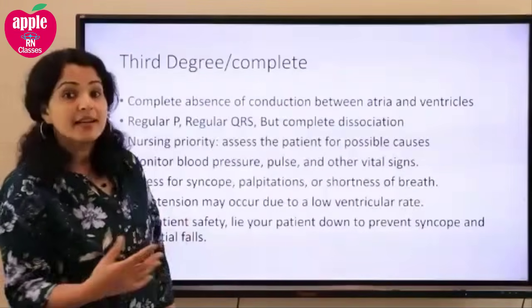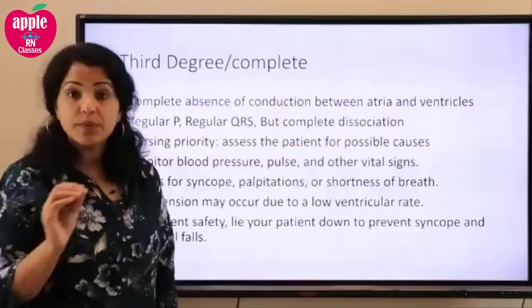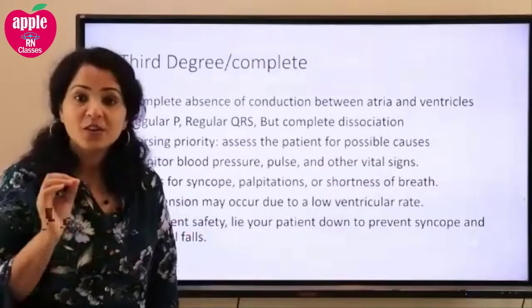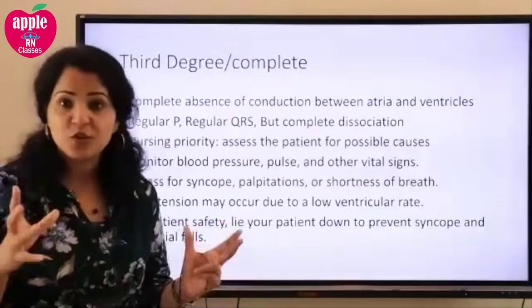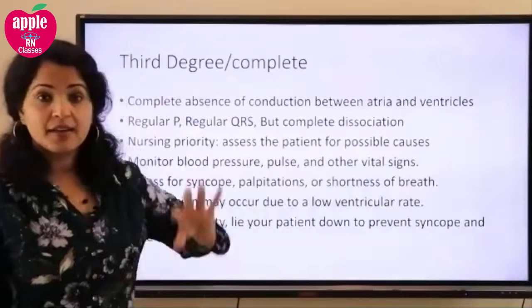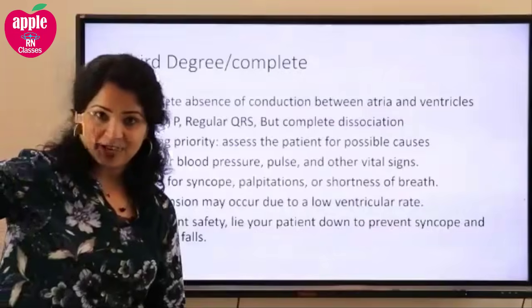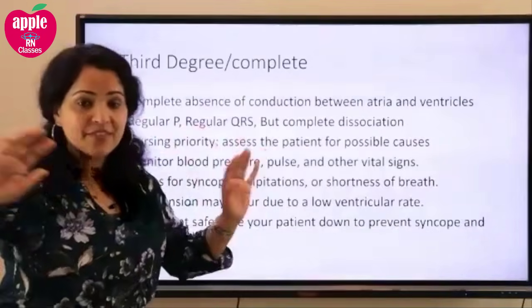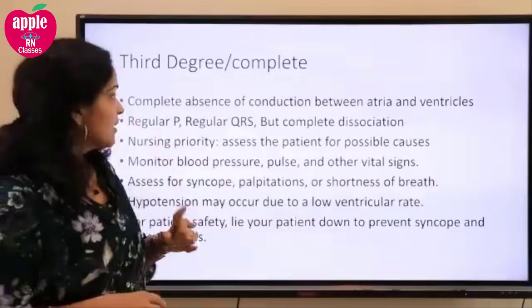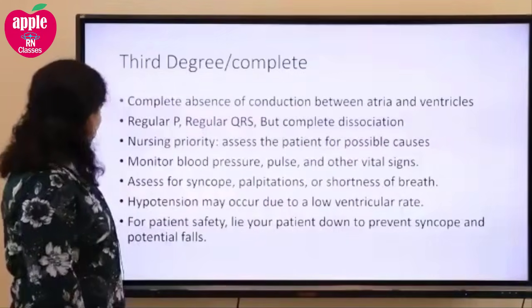And because they are divorced or separated, these two people, meaning the P and the QRS, are not going to be working together. There is no connection between them anymore. The wife has her own schedule, the husband has his own schedule, and they are living their lives completely differently. There is no association. Instead, we will say there is dissociation. Okay, that's the word which you might say.